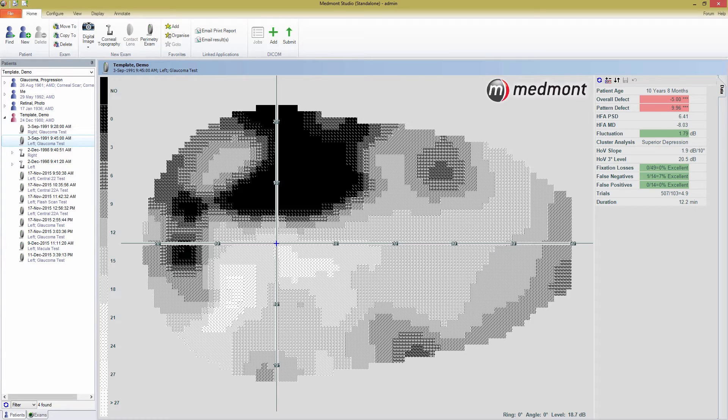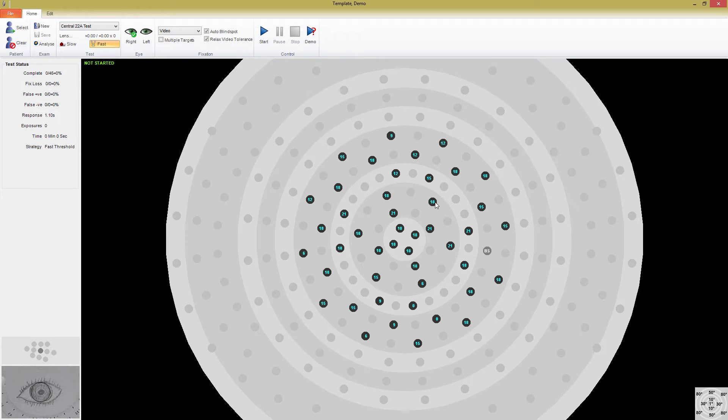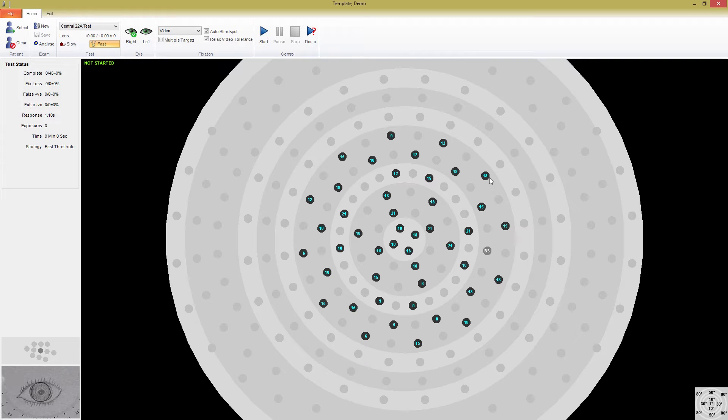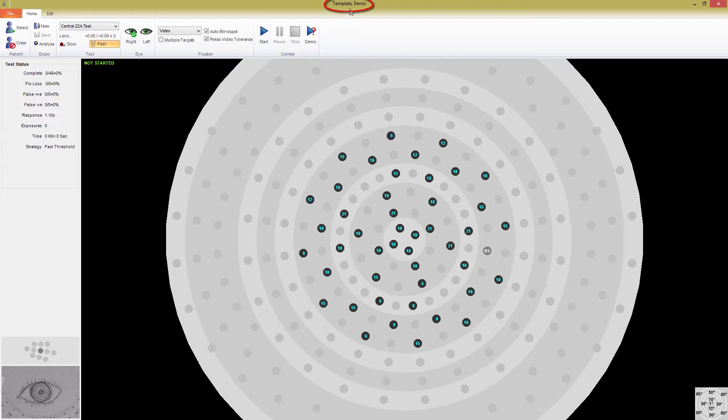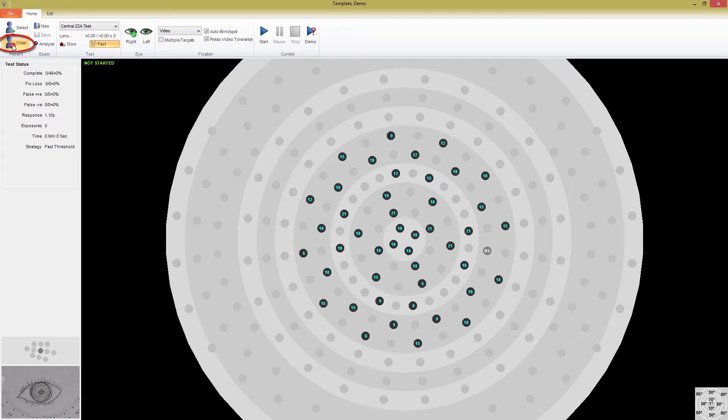This is the main test window, and all the essential features for running an exam can be accessed from here. If you had a patient selected when you started the test window, their name will be displayed in the top window. You can clear this name out by pressing the Clear button in the Patient section of the ribbon bar.